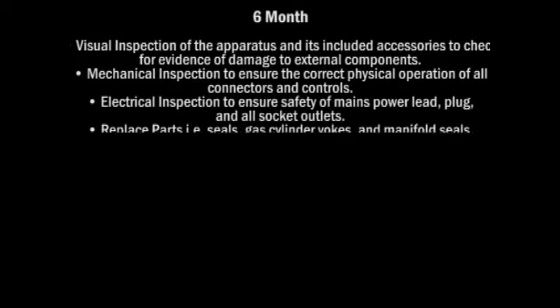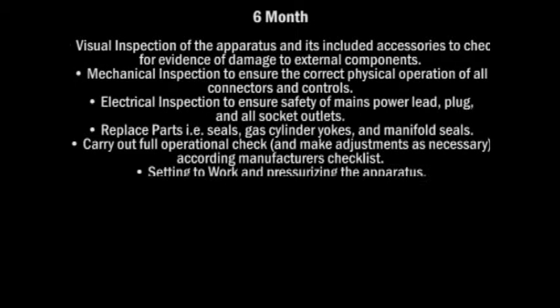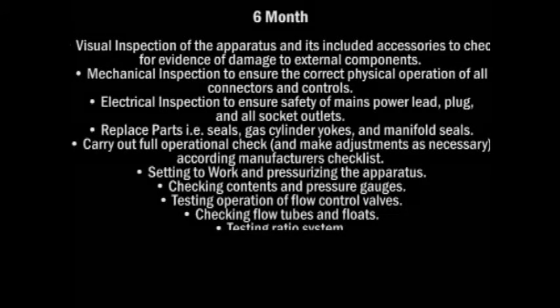Replace parts, for example, seals, gas cylinder yokes, and manifold seals. Carry out full operational check and make adjustments as necessary according to the manufacturer's checklist. Setting to work and pressurizing the apparatus. Checking contents and pressure gauges. Testing operation of flow control valves.